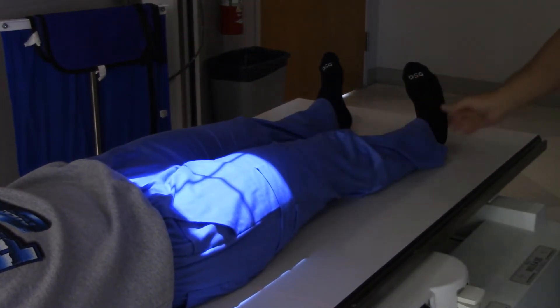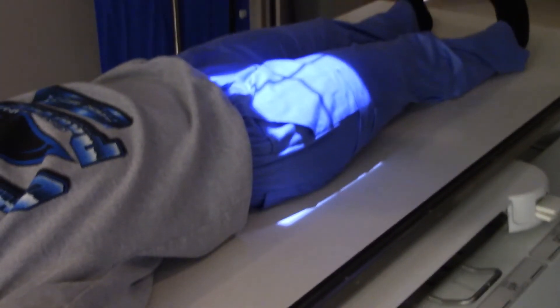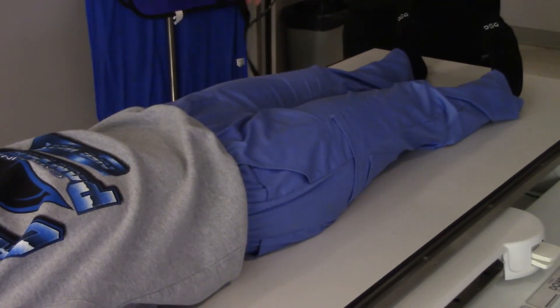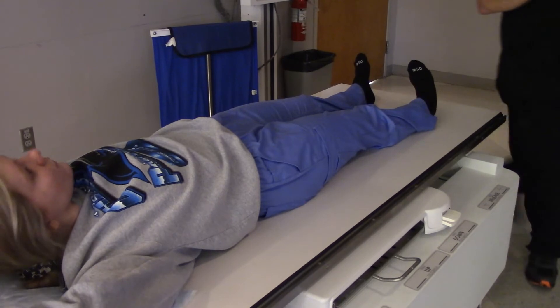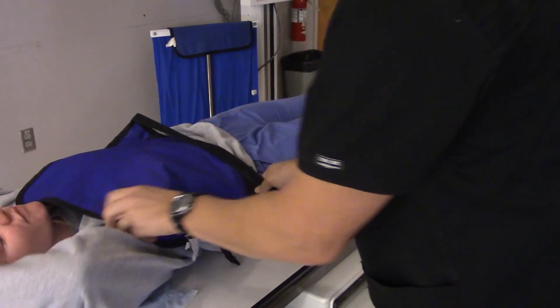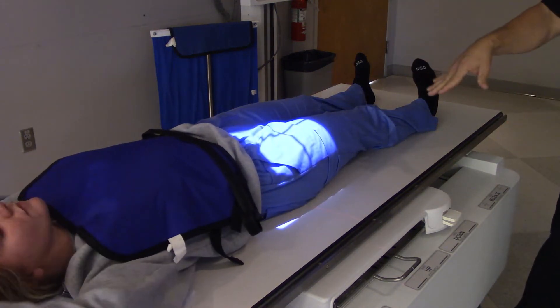I'm going to put my right marker on there. Shielding — I can put a shield on her chest and thyroid, just like that, and now I'm good to go. So there we go — this is the AP unilateral hip.